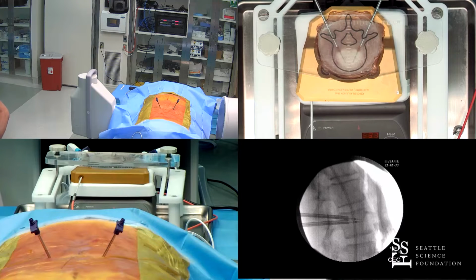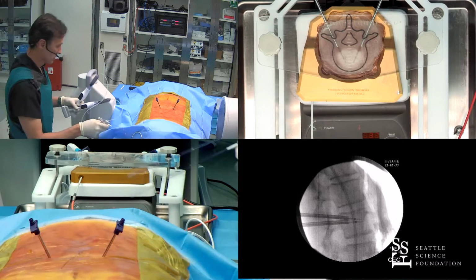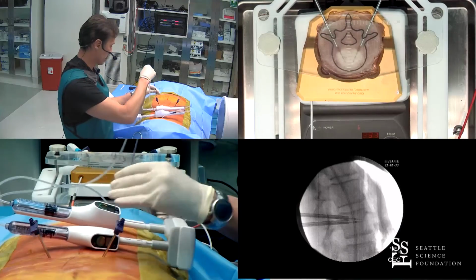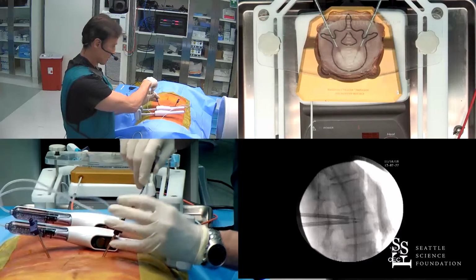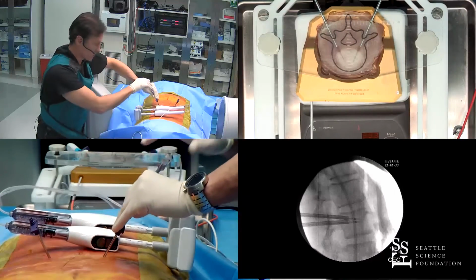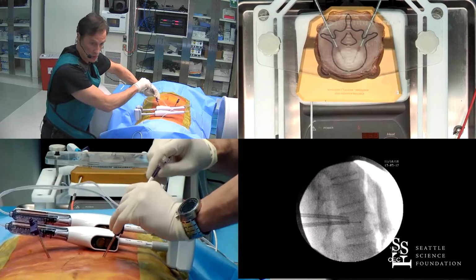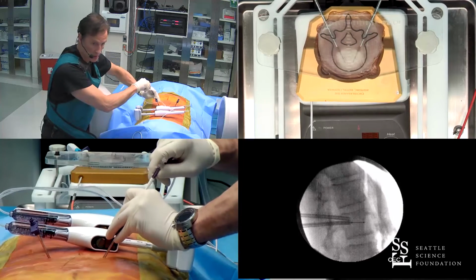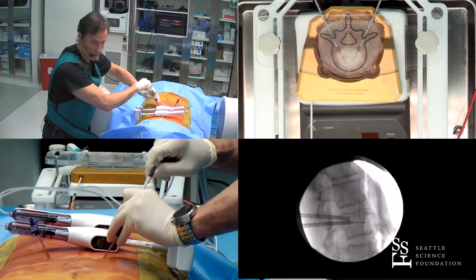Yeah, mix it up. So we're going to mix some Xpede cement. This is quick-to-dose cement. So the balloon will go in. It has marker bands on the proximal and distal portion of the balloon. You can see this pretty easily. Very nice.